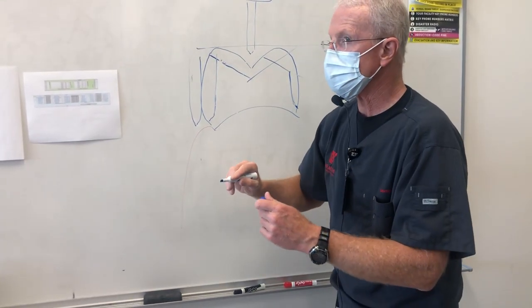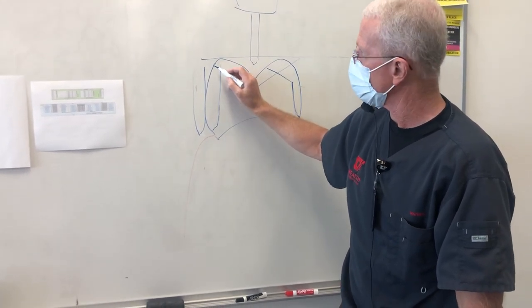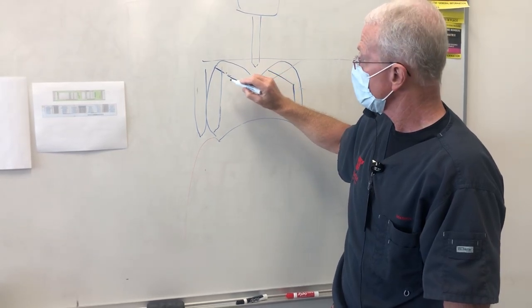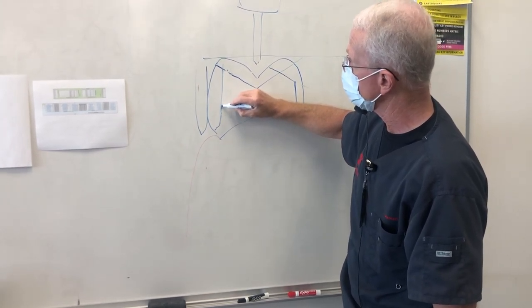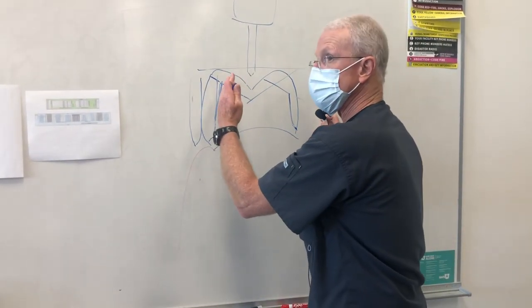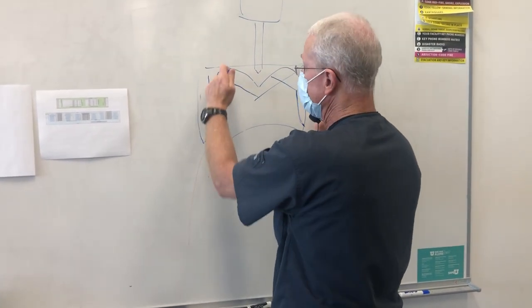you're near the end of your preparation and you look down the buccal aspect of all those teeth, and this sticks out to you. I'm imagining a crown going over the top of this tooth, shaped like those teeth next to it, and it's really thin right here. It's really prominent. So I've got to do that to it so that it's a uniform thickness of material. That's why we do the two-plane facial, just to keep uniform thickness of material all the way around. But if the axis has already done that a little bit, you may not need it.